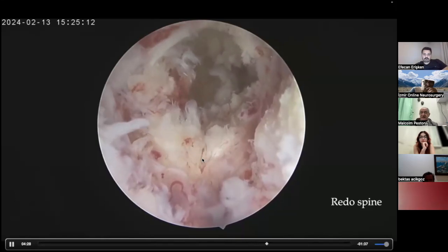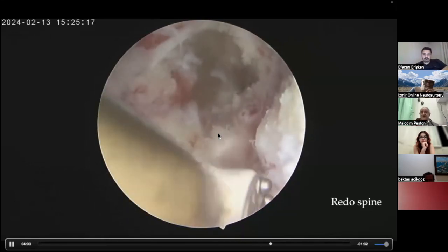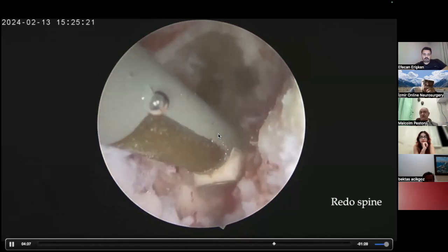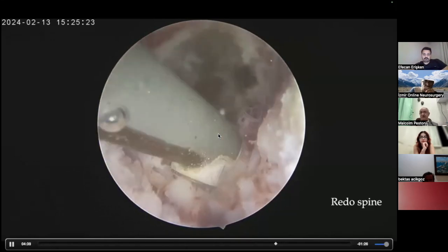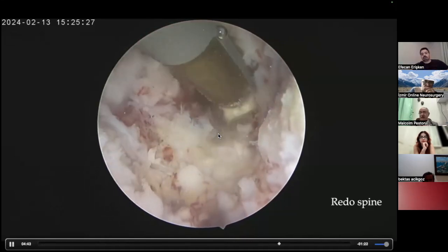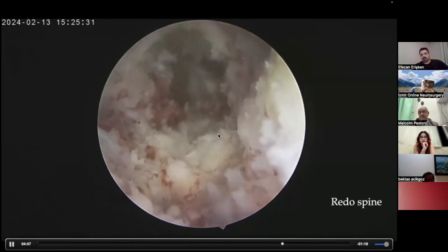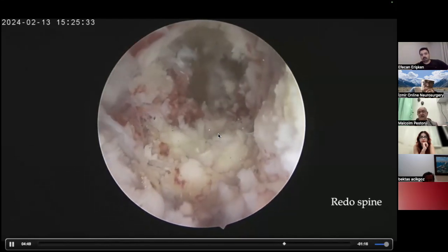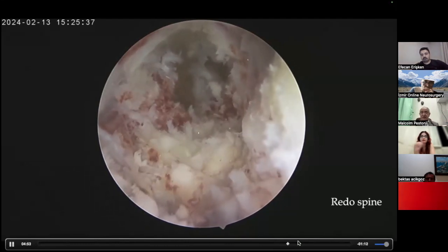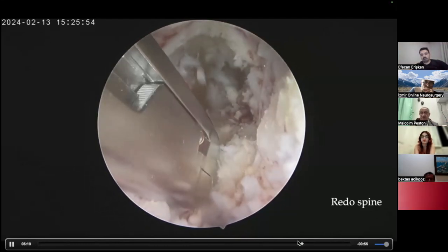So now I've realized one thing. The moment you put in the cage, please look beyond the cage towards your side. See whether you have herniated out something below the root. It's vital. This was a very bad experience for me. This is my own patient, and I will not hide anything, because if the world has to learn, then I have to be honest. My experiences, I think, are a little more than others, and I need to share the good and the bad. So finally removing that disc, removing all that fat around the root first.